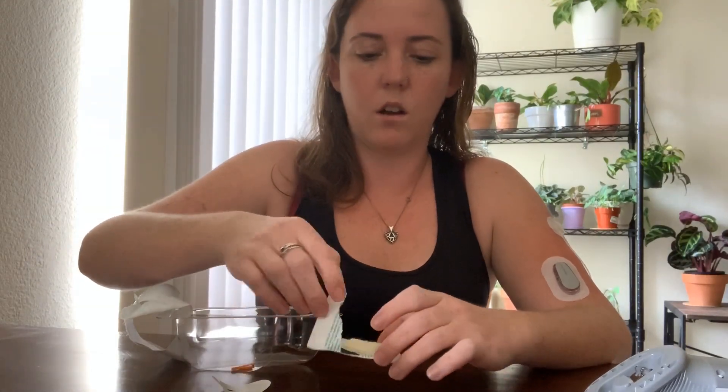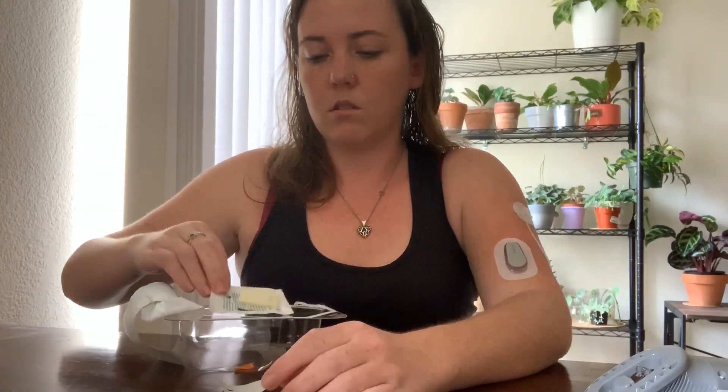I'm starting to feel like my blood sugar is getting a little high. I was at 118 about a half hour ago when I took the sensor off to get in the shower, so it should be fine but I might be trending up a little.